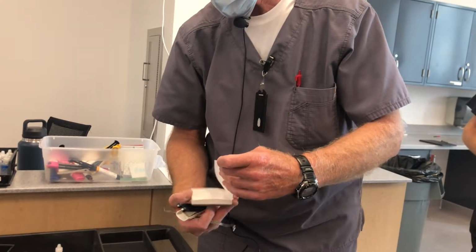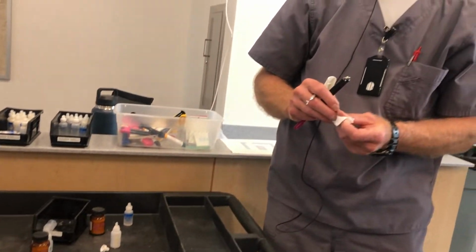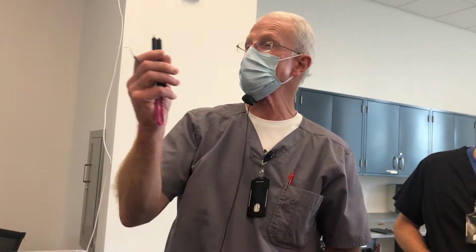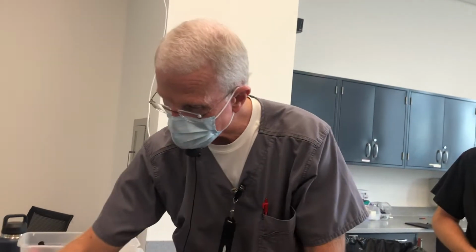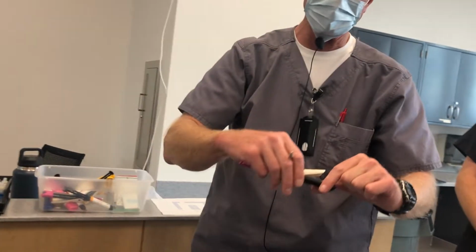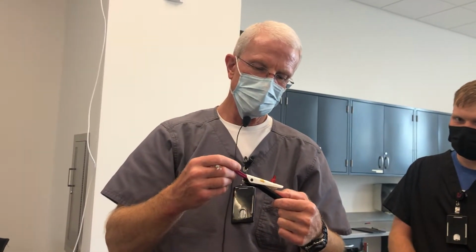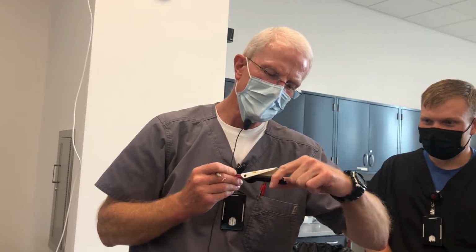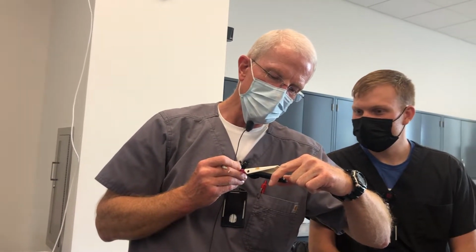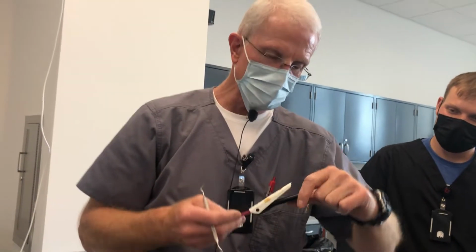If you have a resin that's gone past its expiration date, starting to notice how that one, I mean, that's too thick. You never want to cement anything with that because you can tell this is too thick already. There's just no way that you could. And if we look at the date, it's probably an embarrassingly old December 14th, 2021. '06, back in '06. No, I'm teasing. All right. Well, 2020, not that long ago. So October 28th of 2020.